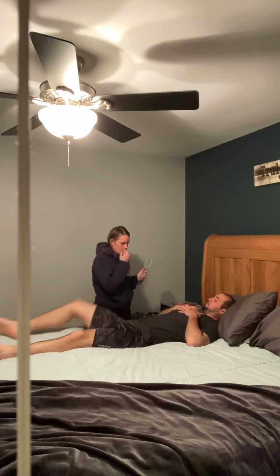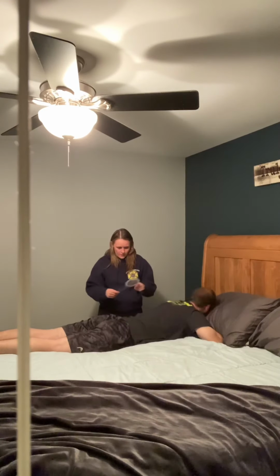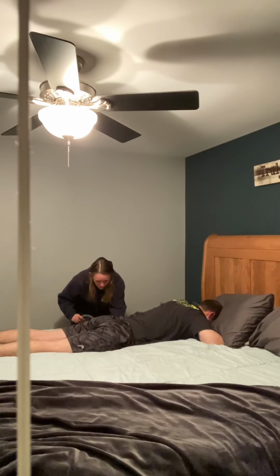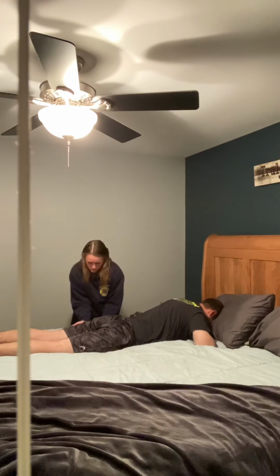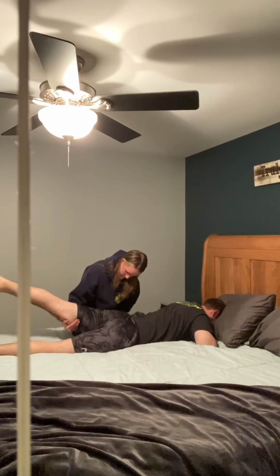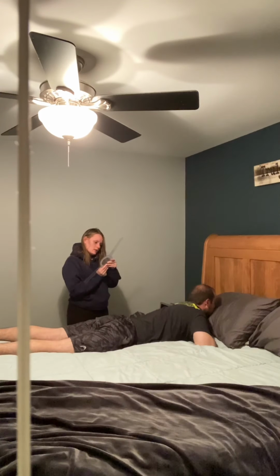So you can turn over on your belly and we're going to do hip extension. Looks like a belly flop. So you're going to use the same landmarks for here, and we are expecting a 20-degree range of motion. So we will palpate for the greater trochanter. We're going to line up. And then what I'm going to have you do is we're going to come here. No, let me do it. And I'm going to lift that leg up. Good. Come back down. And he is at 19.